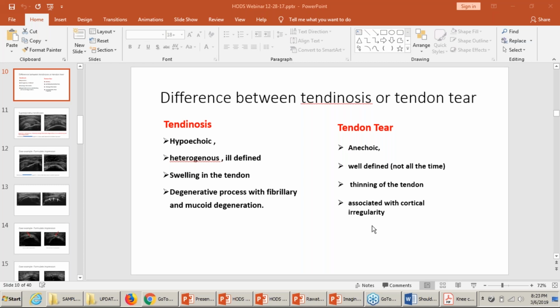So at 6 weeks, for reimbursement purposes, it may be difficult to justify. You can scan it if she's getting worse or shows little to no improvement. I would give at least 8 weeks before you see some changes. Like I said, if you see something dramatically changing in their clinical picture, you can repeat it, even if it's early. But as long as she's not worsening or showing no improvement at all, you should wait. I really cannot give you a specific answer of how many weeks, but I think you should give at least 4 to 8 weeks. I don't have any clear-cut answer for this one.